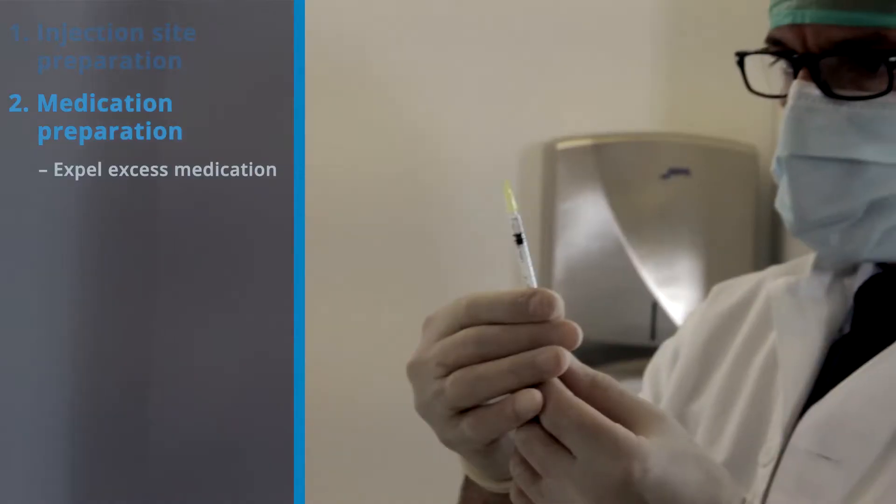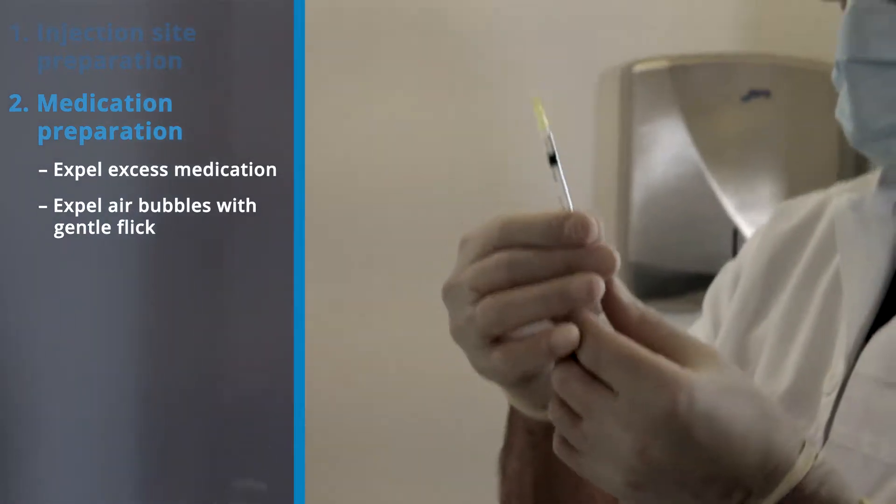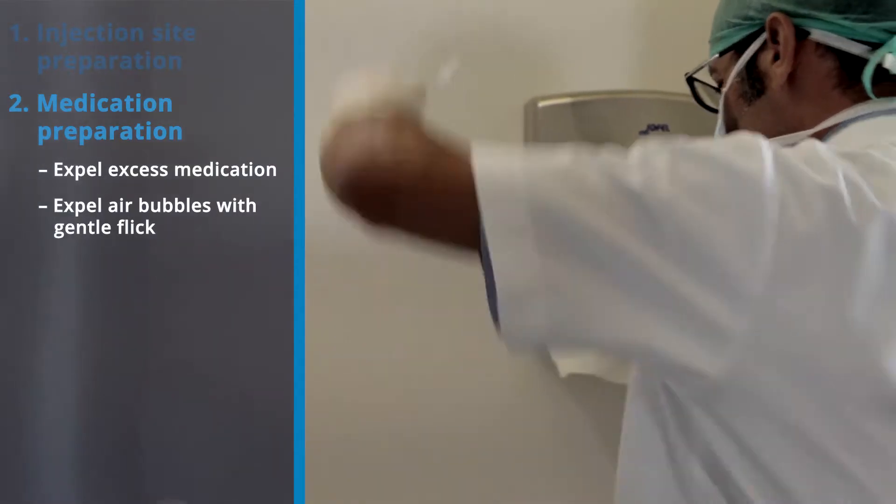The syringe should be inspected for air bubbles. If detected, a gentle flick with gloved fingers will cause the bubbles to rise to the top of the syringe, where they can be easily expelled.